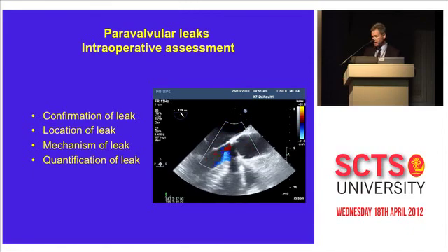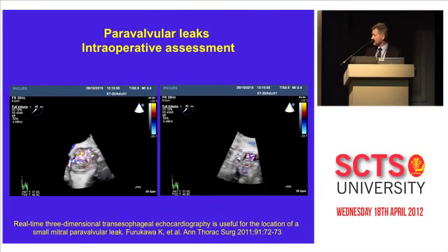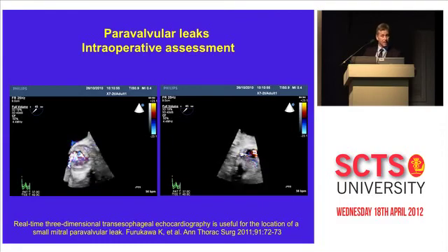So in the long axis, we see this, and it is just a suggestion on the anterior side. We didn't see it with a short axis view, but now we see the outflow tract, the valve itself opening and closing. There's a bit of turbulence across the laminar flow in the outflow tract. And then during diastole, there is some suggestion that on the anterior side, there may be some leak.